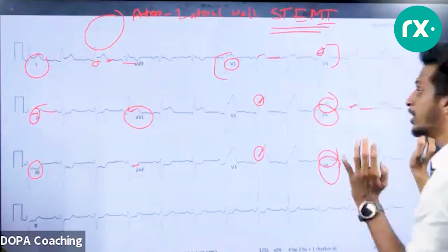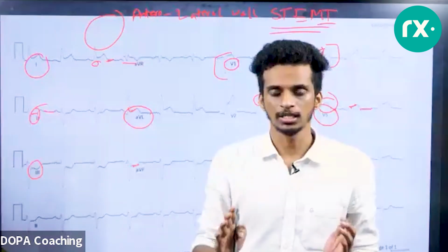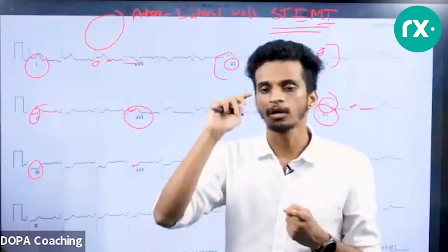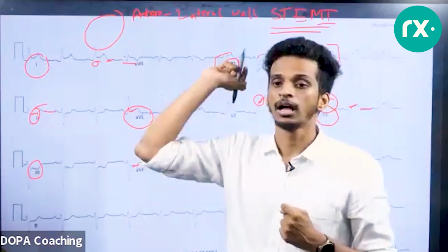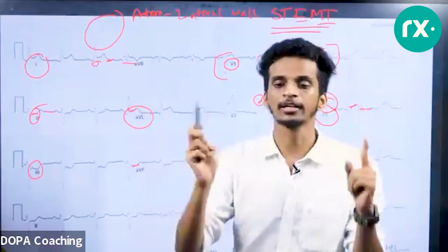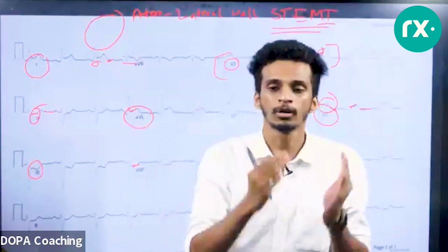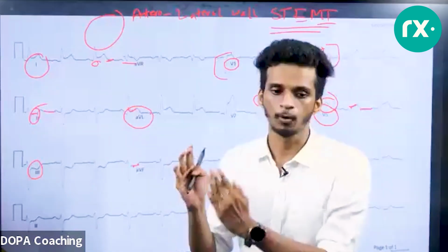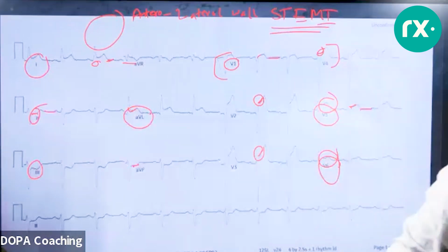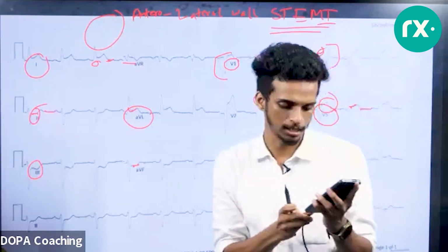What I intended about this session is I just wanted to show you ECGs of certain arrhythmias and certain ischemic changes. Is that clear to everyone? Is any point, is what all I have taught here, what all we have discussed here, confusing, or do I need to repeat any of those points in arrhythmia and ischemic changes? Let me know now.